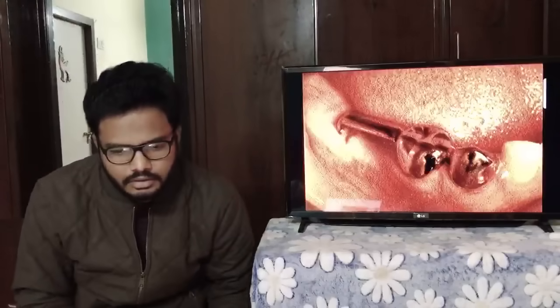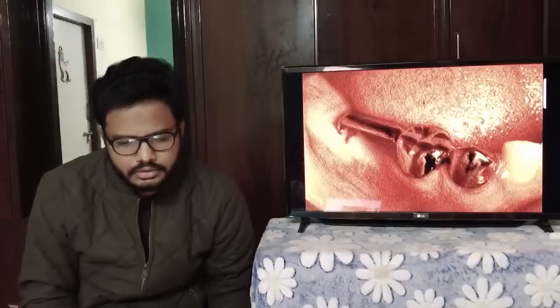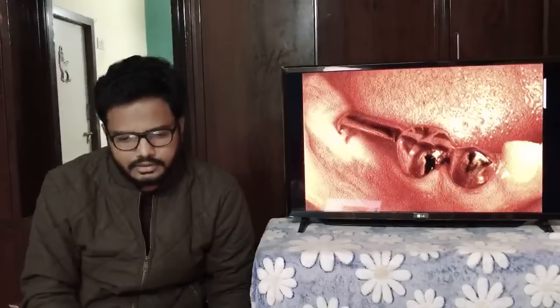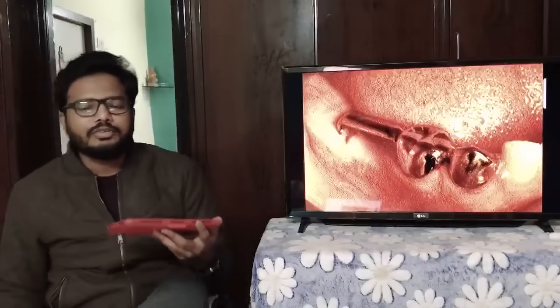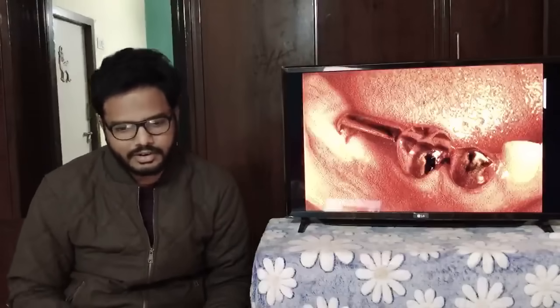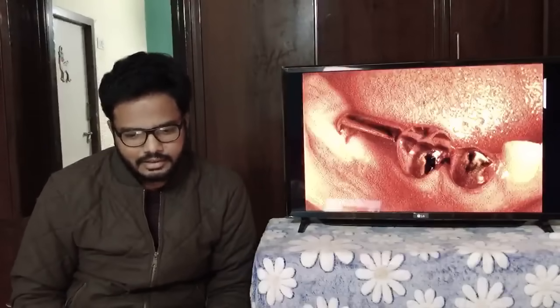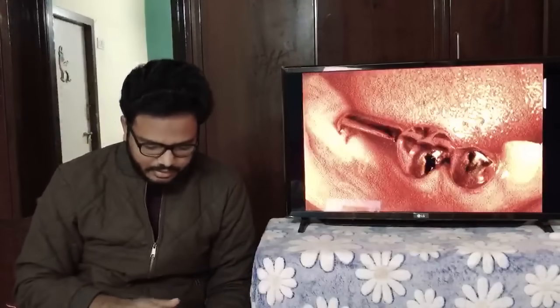Exactly. Yes, Kritika, refer Prophet. You have beautiful images over there. You will not have any confusion. Yes, it's a distal shoe. It's a distal shoe space maintainer.